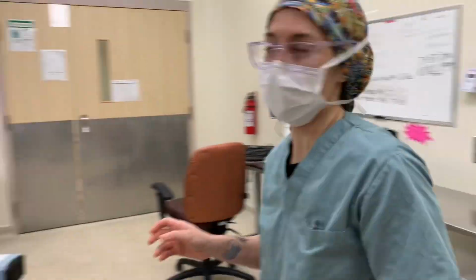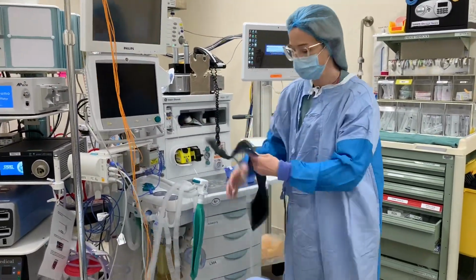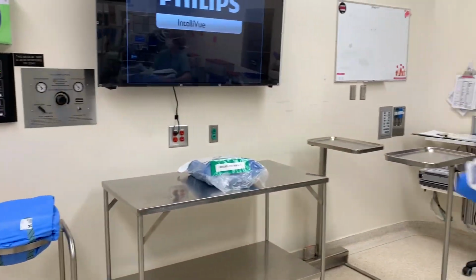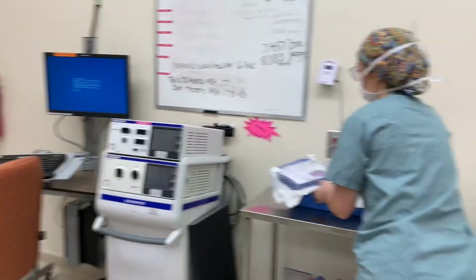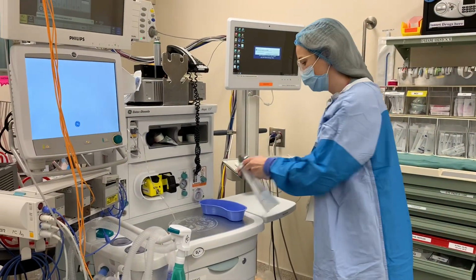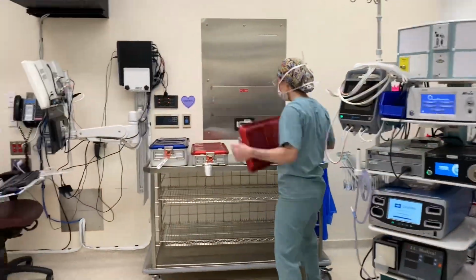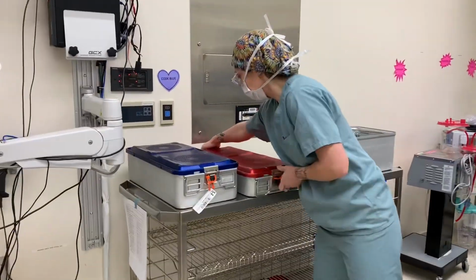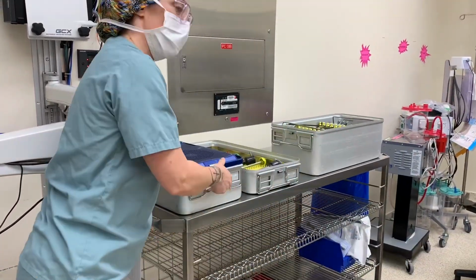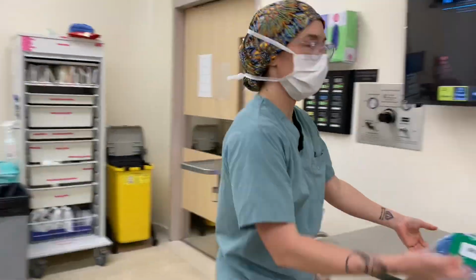The circulator moves to the head of the bed as is often the priority. All the while, the scrub nurse is setting their items and their pack in the appropriate place throughout the room. The gowns go over to the gown table, the pack is on the back table, the basin, etc. The scrub nurse is then opening their pans and has placed the bin of single items to be opened on the edge of the operating table.